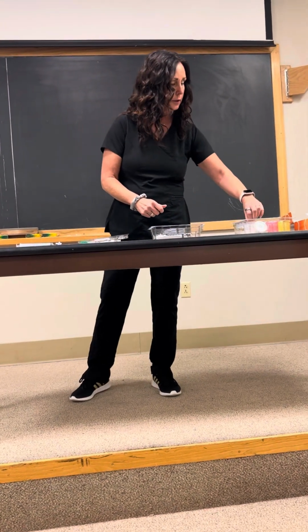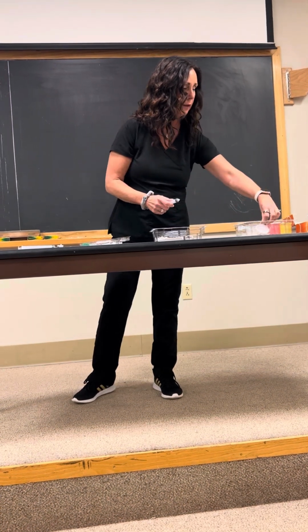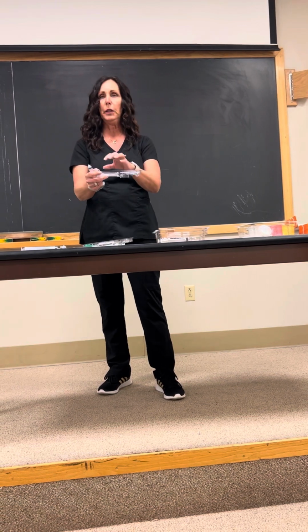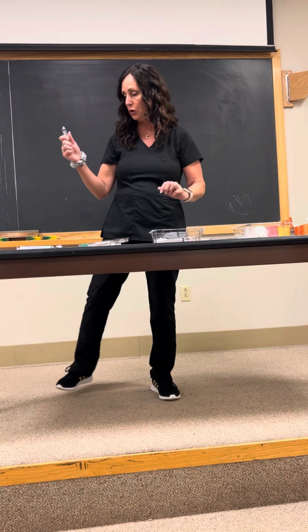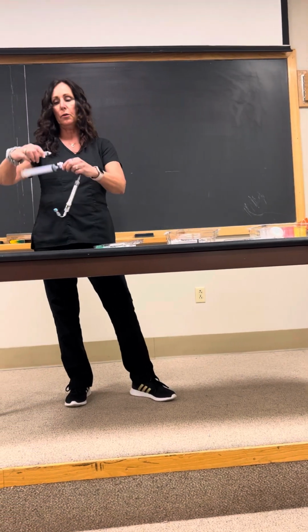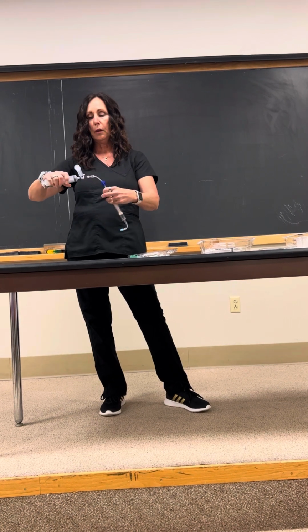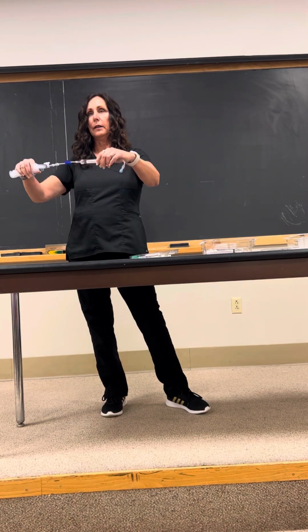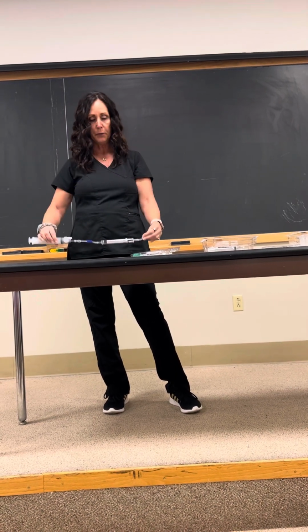I will use the 12 ml syringe that comes in this tray because, from what I understand, the surgeons here aren't gelling the marrow, so there's really no need for this portion of the disposable. But I will use one of the syringes, and I will attach it to this third port here on the stopcock. I'm going to go ahead and have you clamp that clamp on the distal side of the filter.